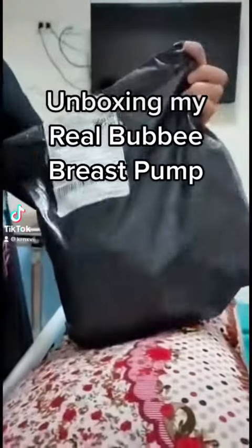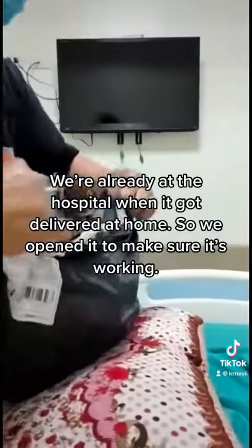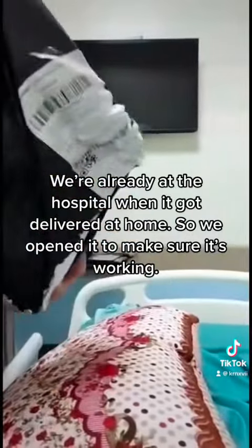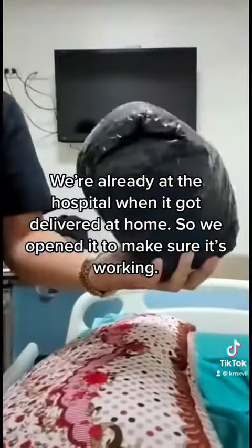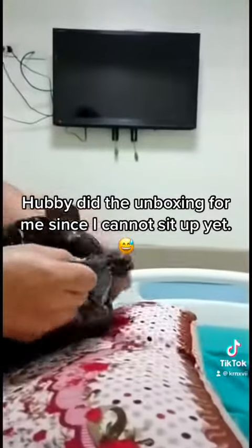Unboxing my Real Bubbee breast pump. We were already at the hospital when it got delivered at home, so we opened it to make sure it's working. Hubby did the unboxing for me since I cannot sit up yet.